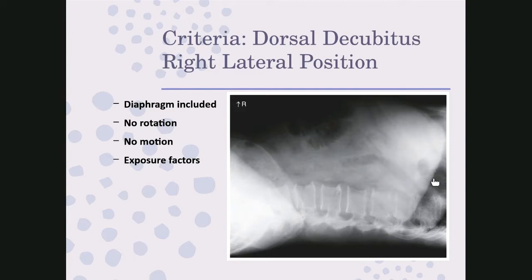Now this, you can see it here, you lose a little bit here. So ideally this would include the entire thing. Like maybe if this image came out just a little bit further and you could see that entire diaphragm. Now it's probably warranted to be okay because you can see it right up until about here and you pick up right here. And I don't see any free air, but if it was supposed to be a really diagnostic image, that should include the entire diaphragm without question.